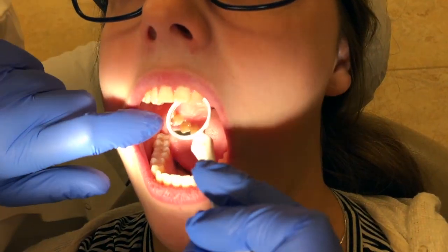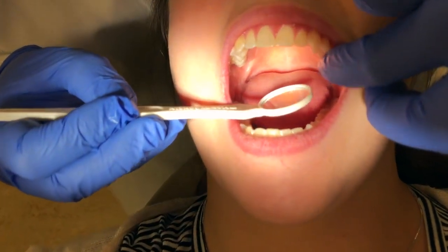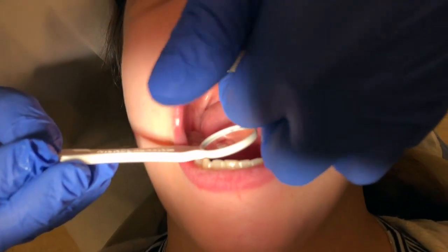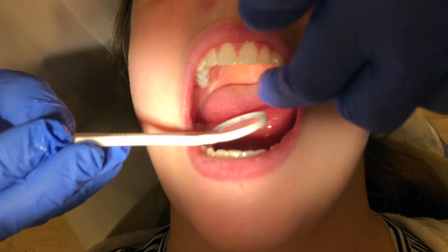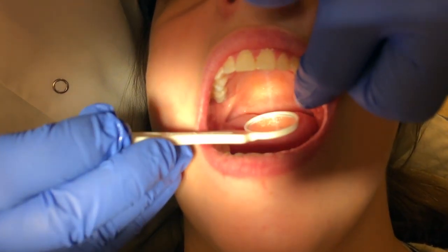Visually inspect the hard palate. Use the mirror for indirect illumination and vision. Digitally examine the hard palate. Visually inspect the soft palate. Use the mirror for indirect illumination.